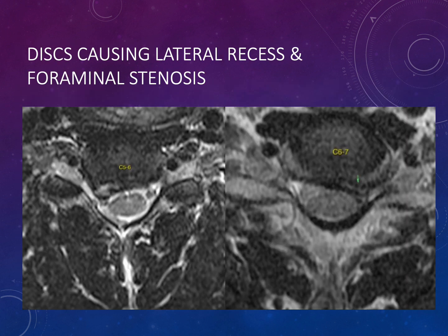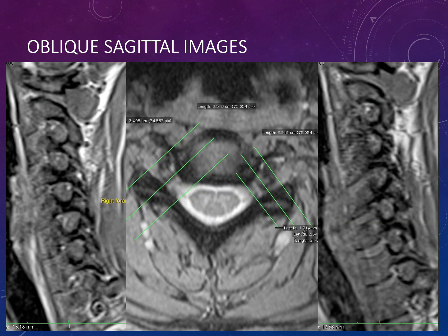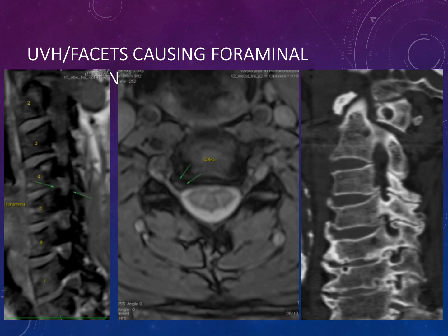Foraminal narrowing can also result from lateral recess disc herniations, foraminal disc herniations, and end plate spondylosis. An effective way to assess the foramen is to acquire oblique sagittal images — reconstructed on CT or acquired on MRI. This is analogous to the oblique cervical spine radiograph and allows you to see uncovertebral spurring and the facets very nicely, on both MRI and CT oblique reformatted images.